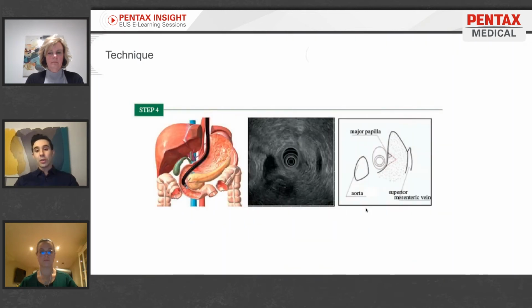And if I push in further, and I want to go assess the underside of the pancreas, so the uncinate process of the pancreas, I'm able just to know that by pushing my endoscope down here, I'm now close to two structures, the aorta and the IVC. I know that they're behind the pancreatic head, and so we will see the aorta, and closer to the probe, I would see the IVC. And then on the other side, I would see other important vascular structures.